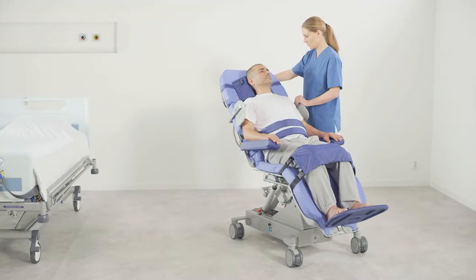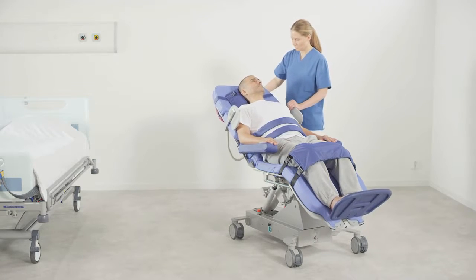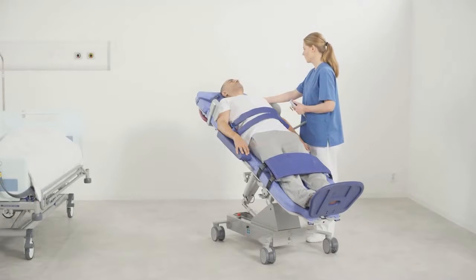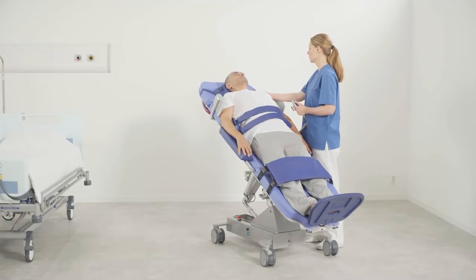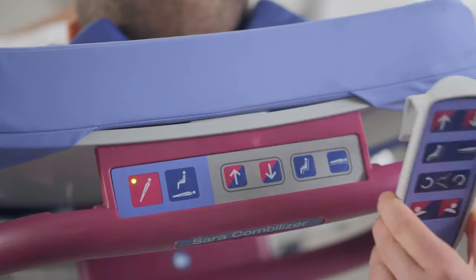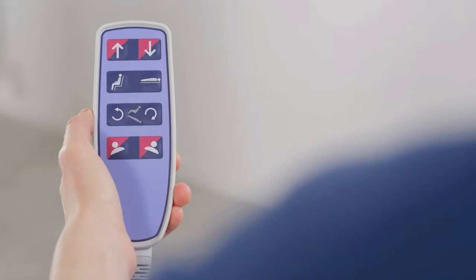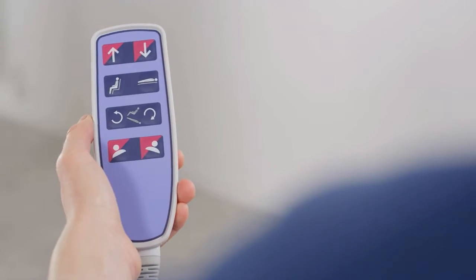Sara Combilizer has two modes. Normal mode brings the patient into sitting or recumbent position, lying down position. Standing mode makes it possible to lift the patient from lying down into standing position. Modes can only be changed using the control panel. Sara Combilizer positions are called stretcher, chair, and tilt table.